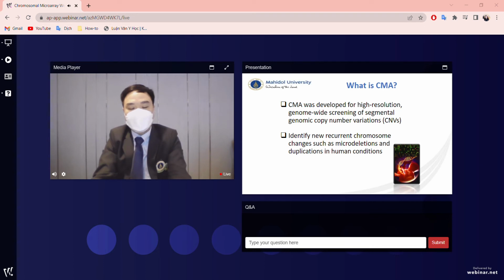So, I will begin by filling you in on the background of chromosomal microarray, or CMA. CMA is a molecular cytogenetic test used to determine if there are chromosomal imbalances called copy number variants, or CNV. Large CNV such as a whole extra or missing chromosome is also detected by standard karyotype. Smaller extra CNV are called microduplications, and missing pieces of genetic information are called microdeletions.